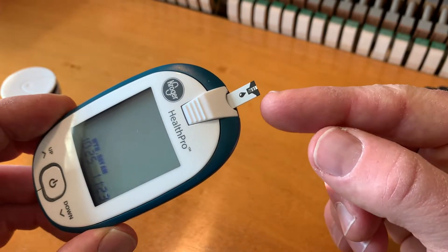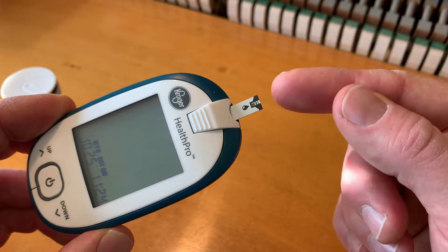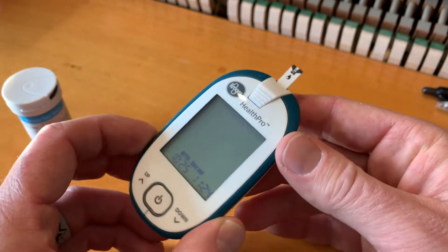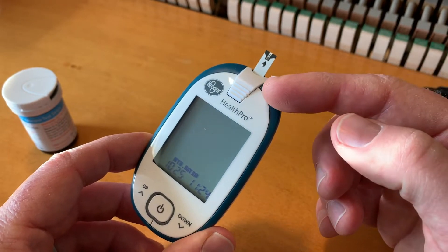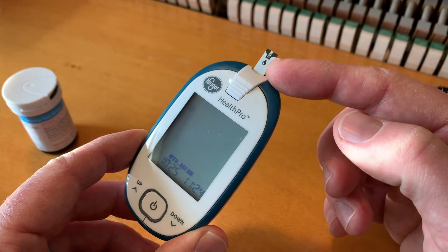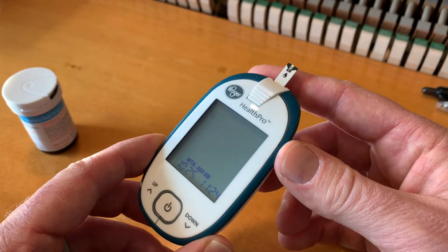Once you have the little strip sticking out like this, you can see where the blood is now going to be inserted. You're going to use your lancer, prick your finger, put it up against that, and it'll take about five seconds to read. I'll make a few more video tutorials showing exactly how I do that. But this is what it should look like — with that little marking up and out so you can put that little sample of blood on the end.